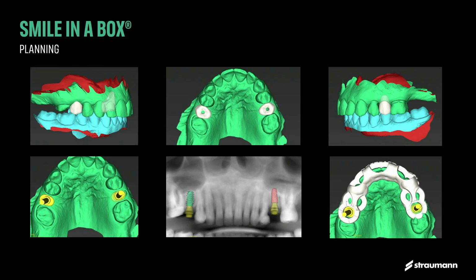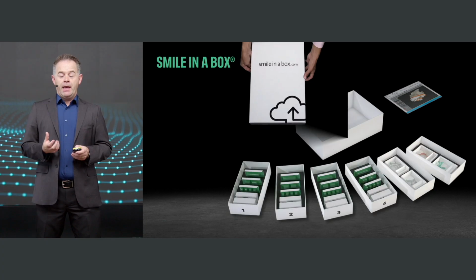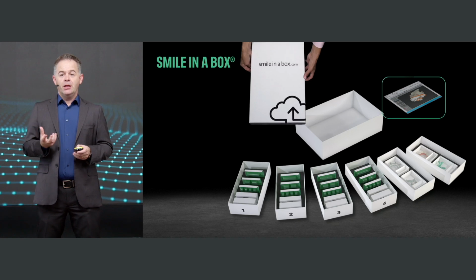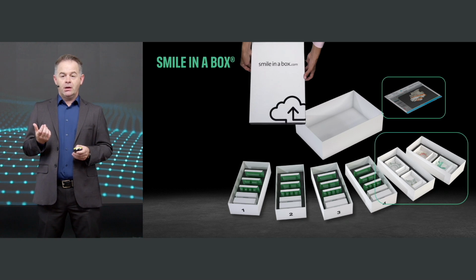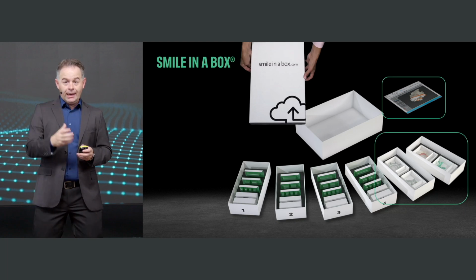We also ask them to design the guide, because we're going to do this surgery with guided surgery for a more precise placement. So you see the guide has been designed, and next thing you know, a box will be sent to you. And when you open, you see the planning that you ordered. You will receive also a box with the guides, because we ordered the planning, the design of the guide, and the guides.